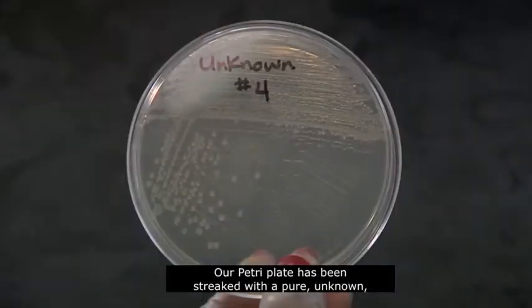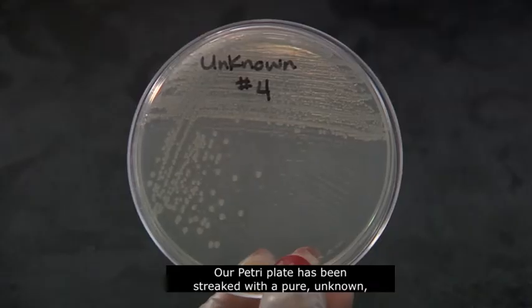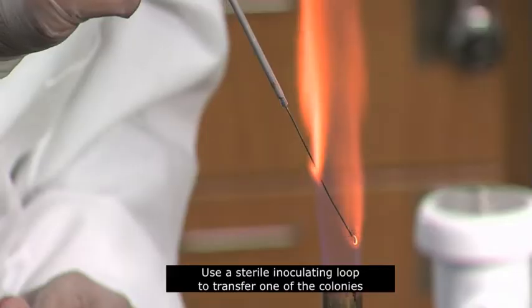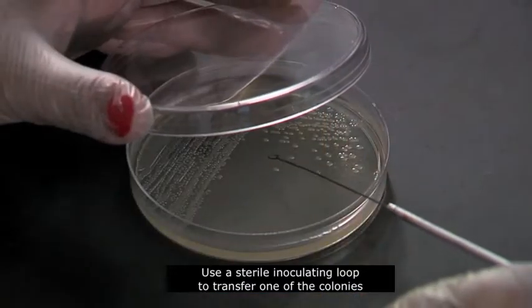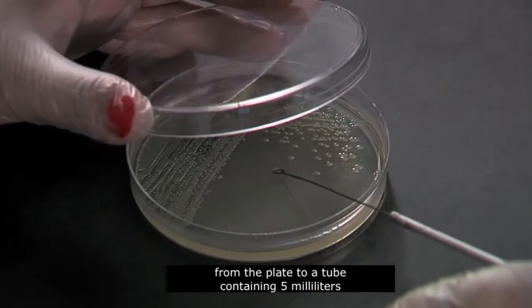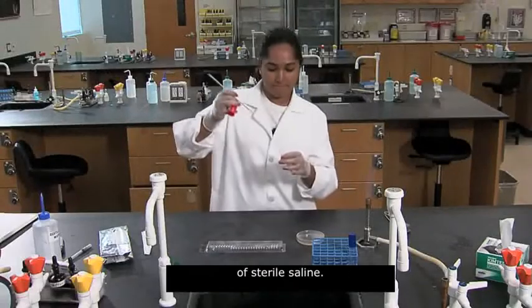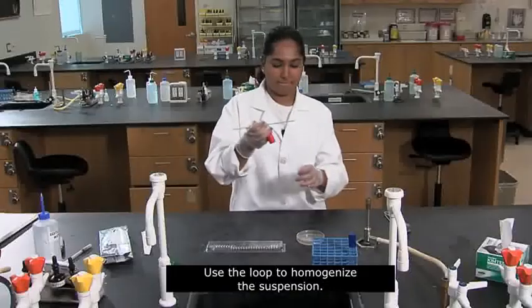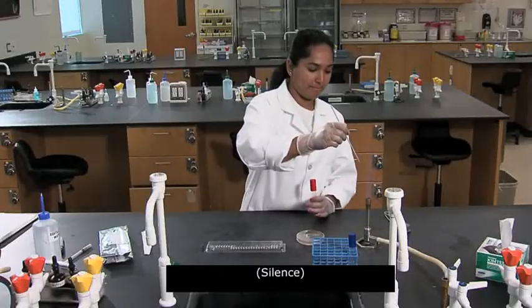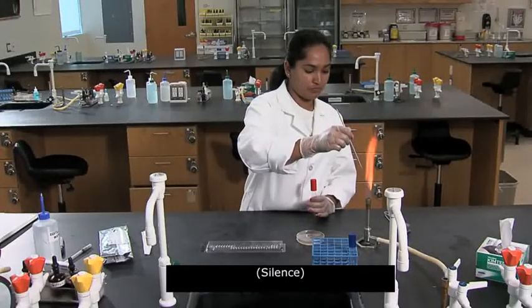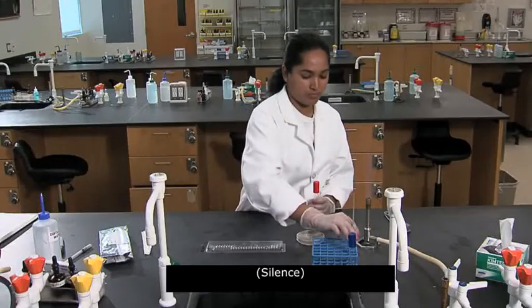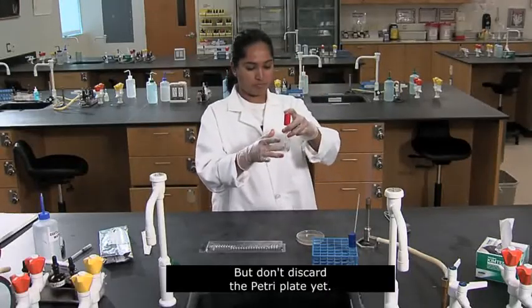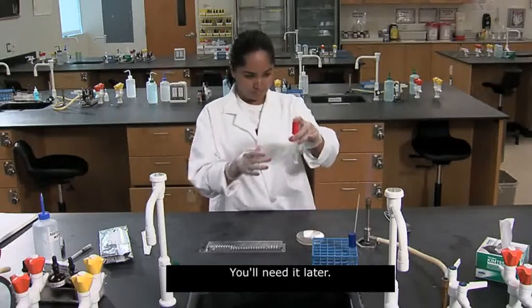Our Petri plate has been streaked with a pure, unknown, gram-negative bacillus. Use a sterile inoculating loop to transfer one of the colonies from the plate to a tube containing 5 milliliters of sterile saline. Use the loop to homogenize the suspension. This will be our working solution for the entire test. But don't discard the Petri plate yet. You'll need it later.